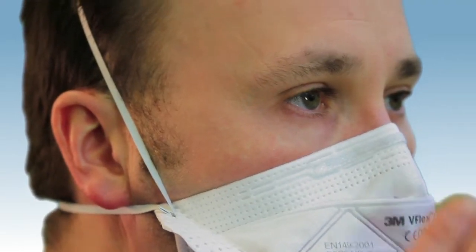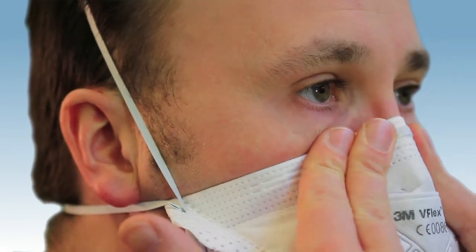Using both hands, mould the nose clip around your nose and cheeks. Pinching the nose clip using only one hand may result in less effective respirator performance.